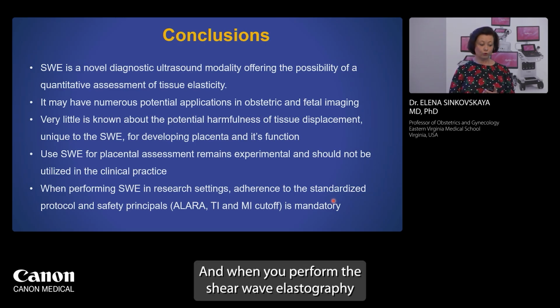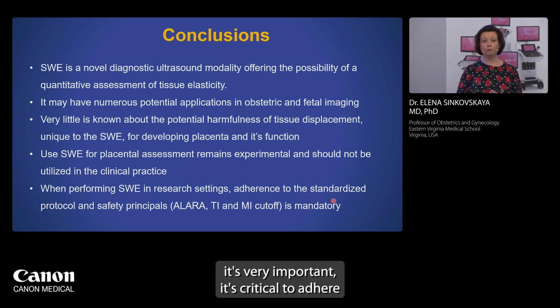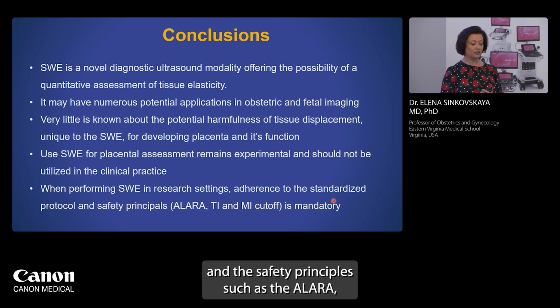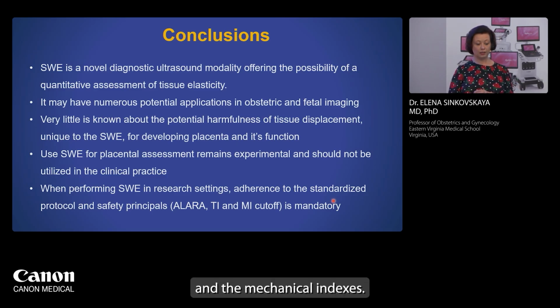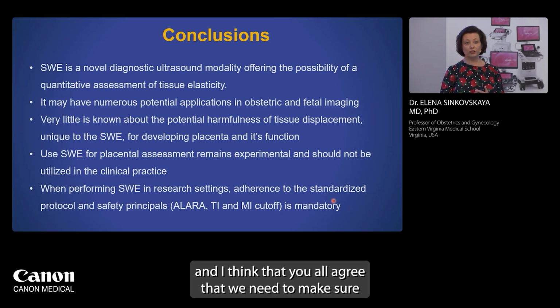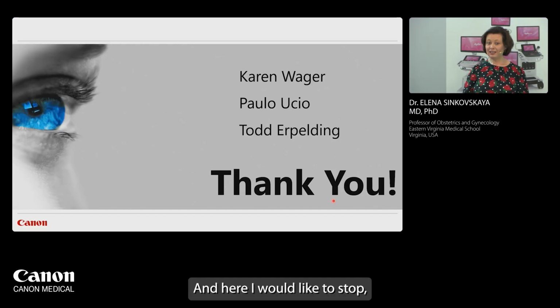And when you perform the shear wave elastography within research settings, it's critical to adhere to the standard protocols and safety principles such as ALARA, and also to minimize the thermal and the mechanical indexes, and this is mandatory. And I think that you all agree that we need to make sure that the safety of our patients takes priority. And here I would like to stop.